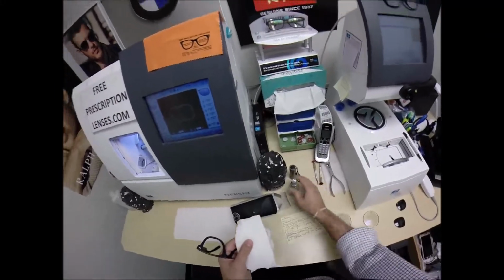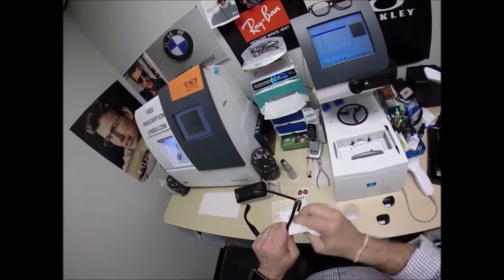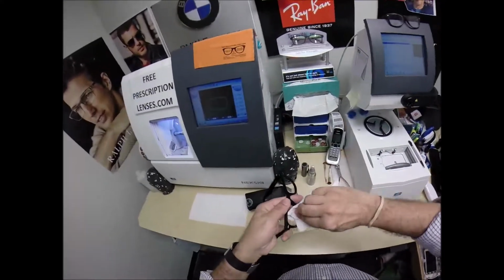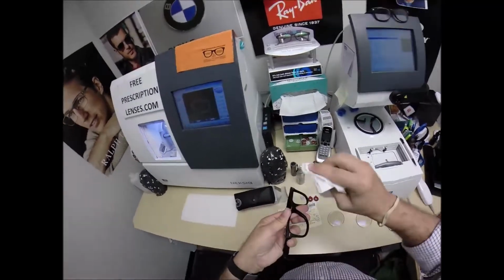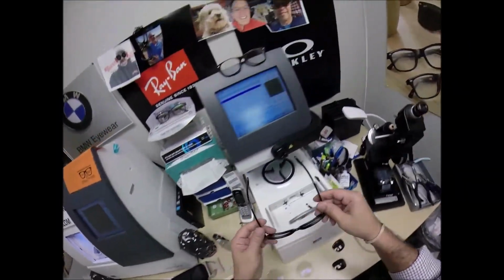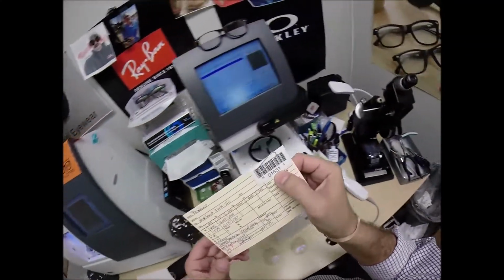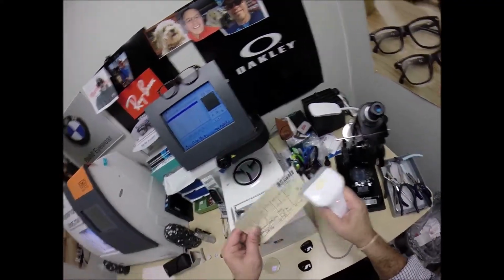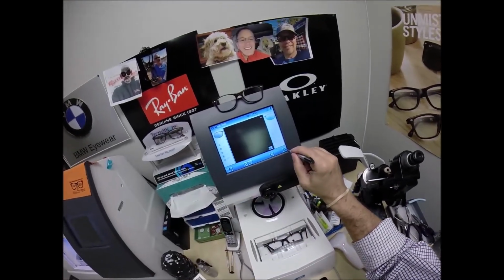The original glass lenses I like to clean. I'll use a little bit of this. This is what your lenses actually come wrapped in. I save these to clean the equipment at night, but I want to clean out the inside bevel in case there's any adhesive left over from when they put the lenses into the frame. That's cleaned out. I'm going to put your frame into the tracing element of my blocker. You are Secret Agent 1631, so years from now, should you ever need new lenses for this frame, I can mail them right to your home.